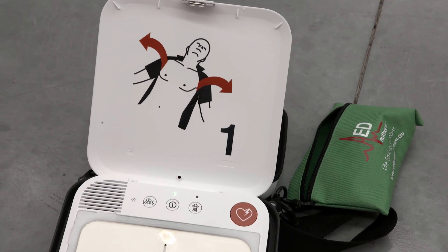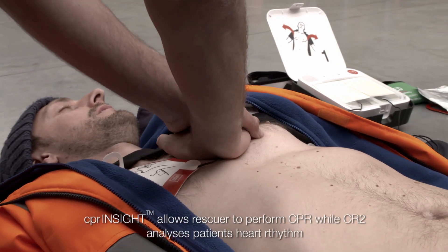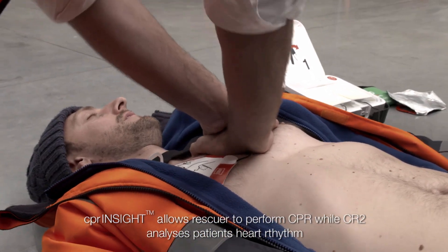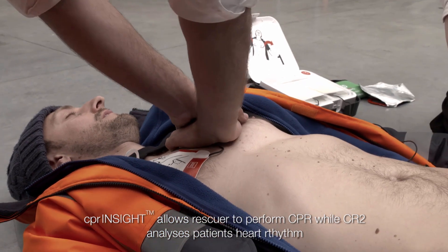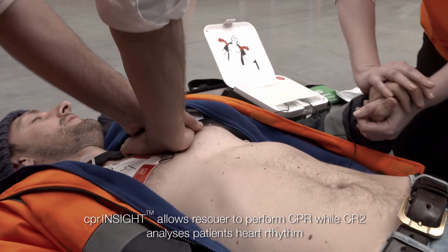Do not touch the patient while analysing heart rhythm. Provide chest compressions to the beat and push down hard at least 5 cm. The CR2 will analyse if a shock is required.